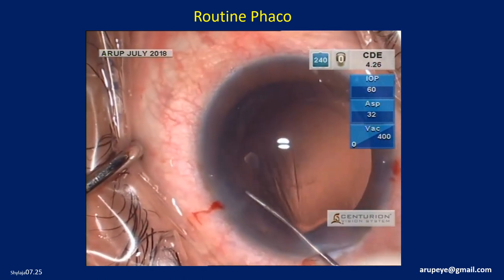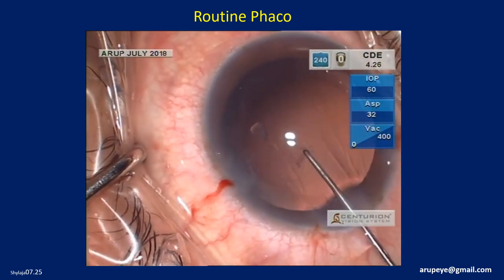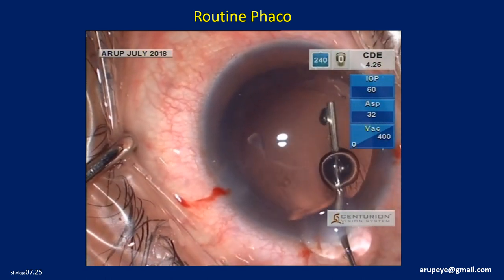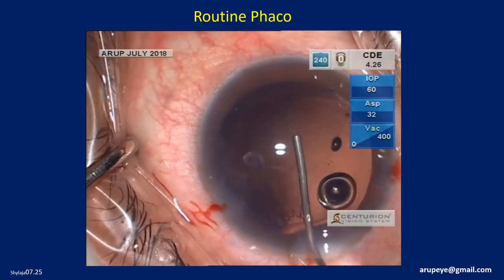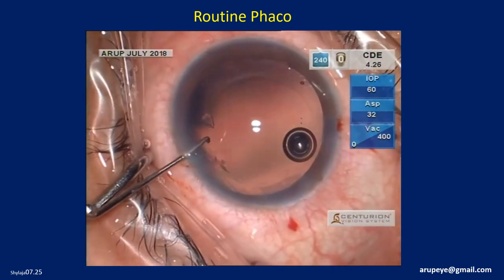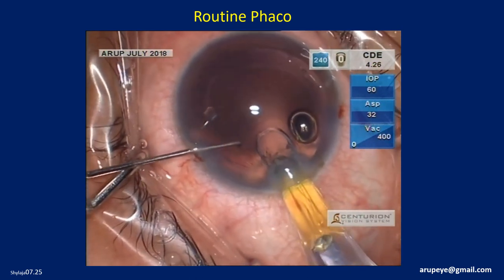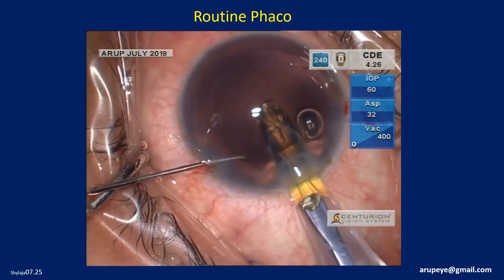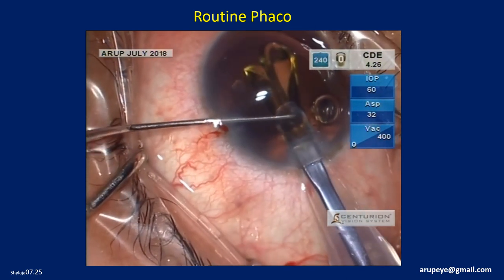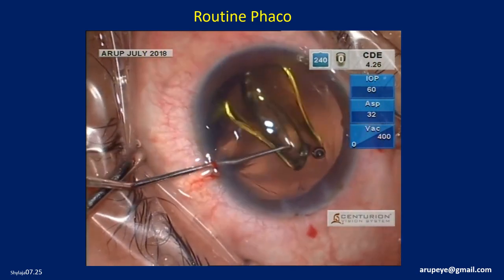We will be implanting a single-piece hydrophobic acrylic lens into the capsular bag. The left-hand instrument stabilizes the occasional bizarre unfolding of the trailing haptic. The entire lens is maneuvered into the capsular bag before complete unfolding of the haptics.